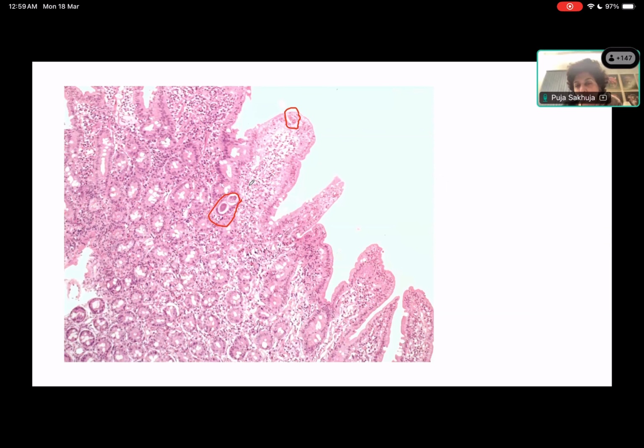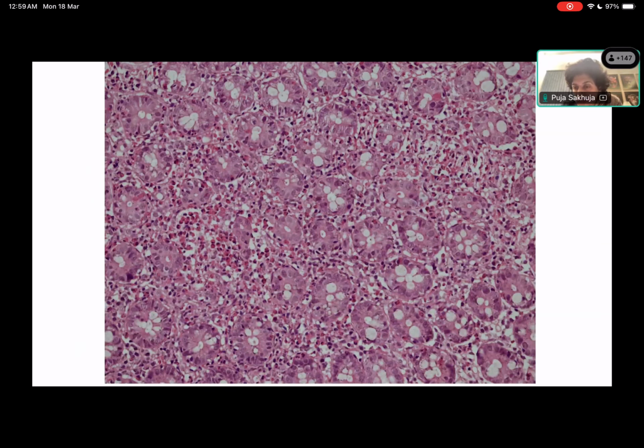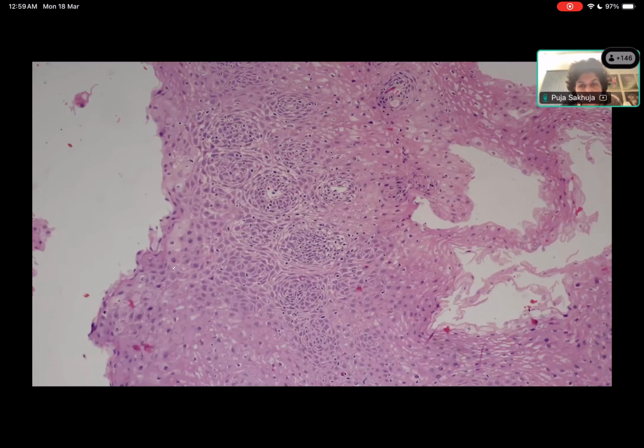And so here you're seeing eosinophilic duodenitis, and in this particular case, this eosinophilic duodenitis and enteritis was related to the presence of a parasite, right? Yes. Okay, now I will show you one or two other slides just to complete this eosinophilic esophagitis topic. Now, this is another biopsy from the esophagus. Do you mind if we do another 5 or 10 minutes? No, ma'am, it's okay, we can continue. Okay. Yeah, Pooja, please go ahead. Thank you. So here we have another esophageal biopsy.